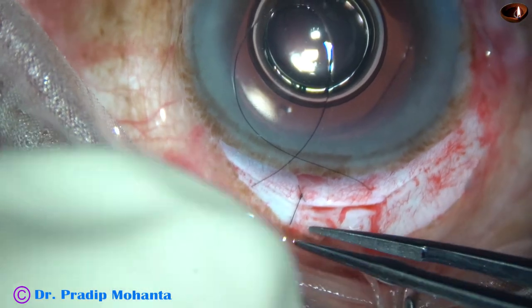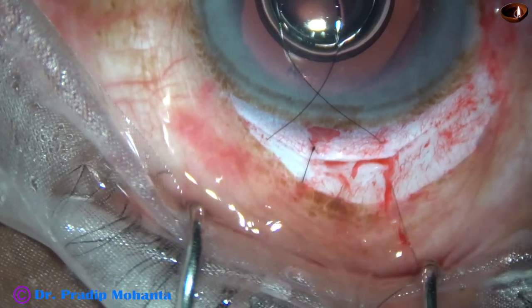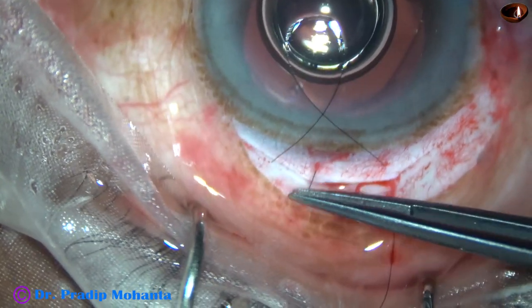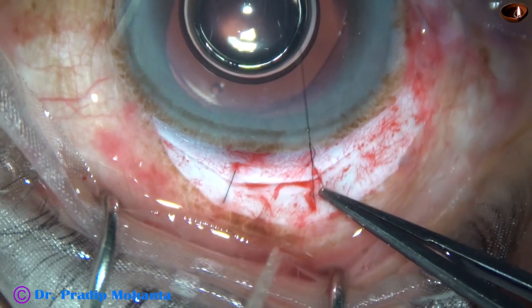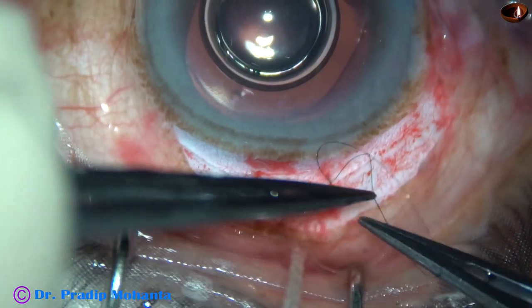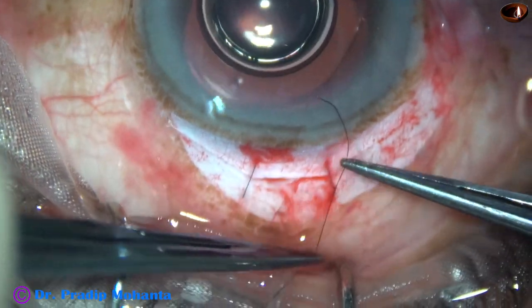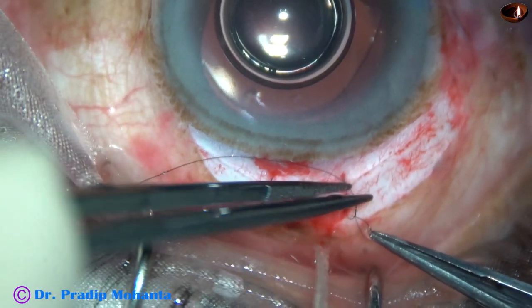I will try to bury the knot. As I try to bury the knot anteriorly, it becomes difficult. So I am trying to pull it and bury the knot posteriorly — and it goes easily in the wound. But it is not always so; you can bury the knot anteriorly also, but in that case the anterior lip of the wound tries to evert. So it is better to bury the knot posteriorly.